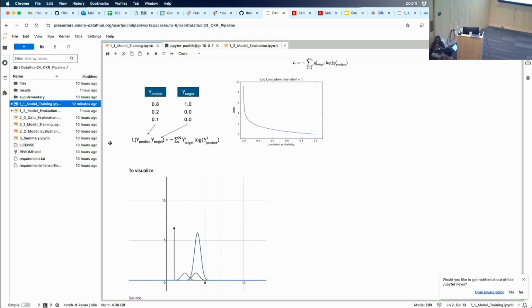Yeah, because this is a binary task, right? Something is there or not there, right? So we need 0.5, like, is that there or not there, right? So we need to either bring everything close to 0 if it's absent, and bring everything close to 1 if it's present.